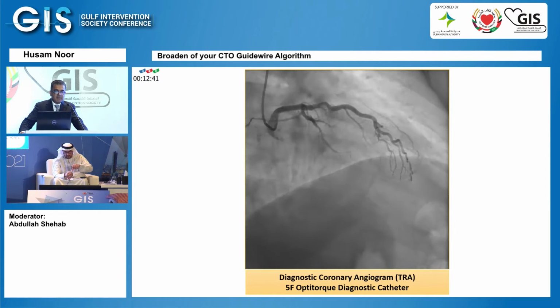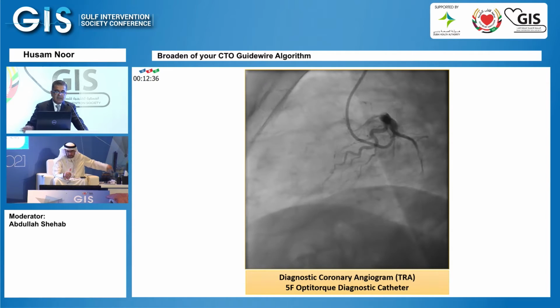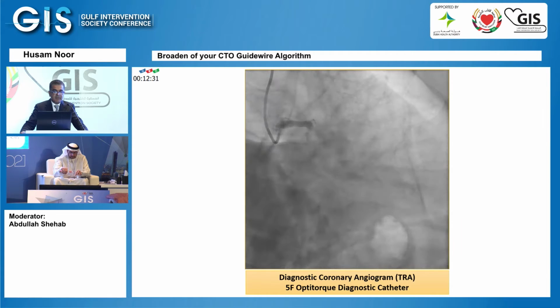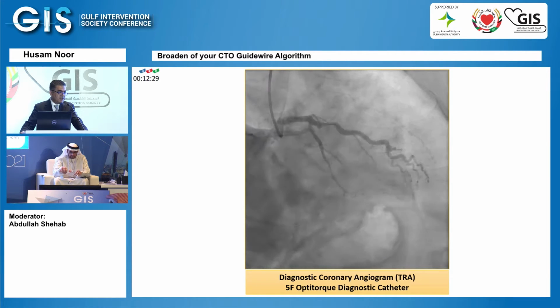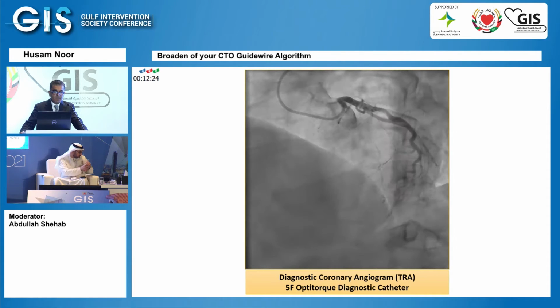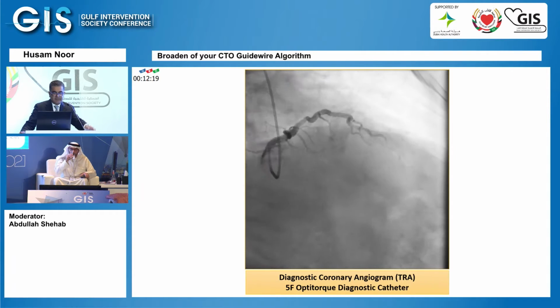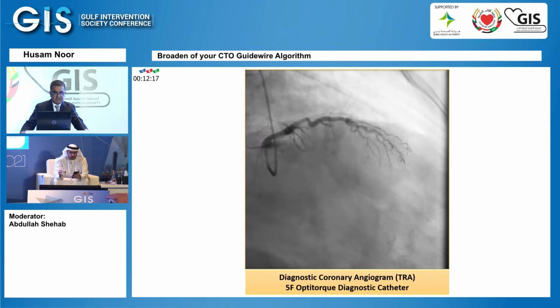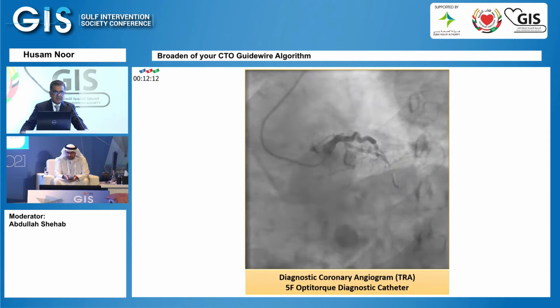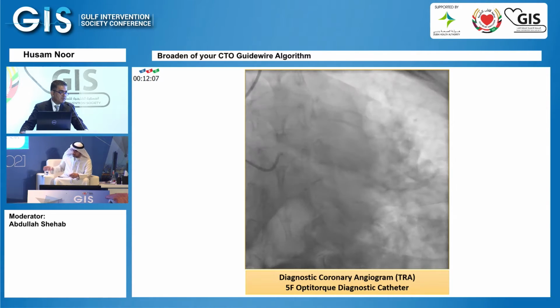And the left system has some mild disease in the ramus. And as you can see, the LAD is occluded, and there are some collaterals from the ramus system to the left anterior descending system as well. You guys could stop me at any point. We have about 15 minutes to finish this presentation. On this initial diagnostic angiogram, the LAD is a flush occlusion from the left main.